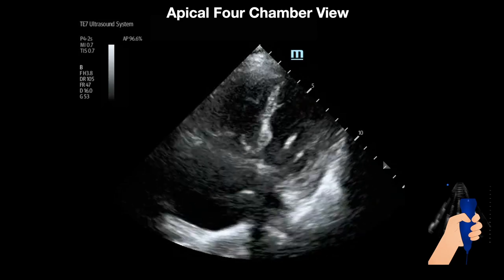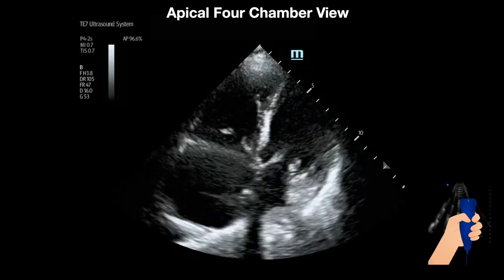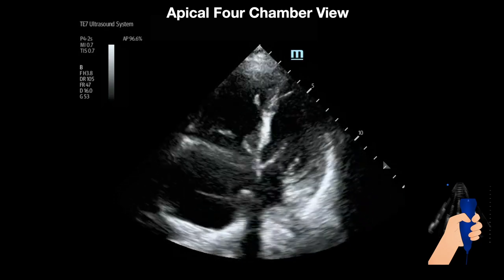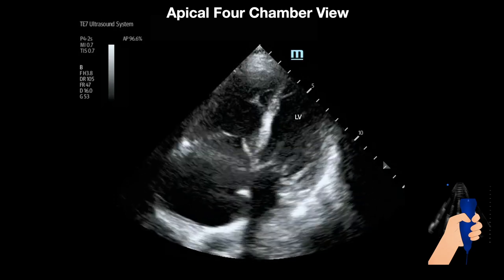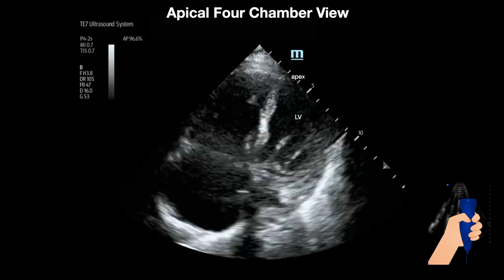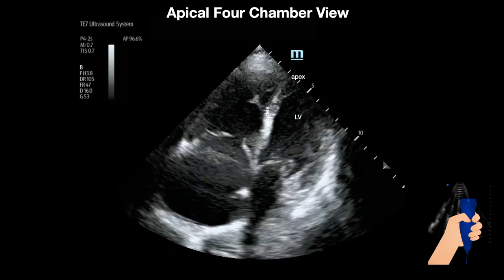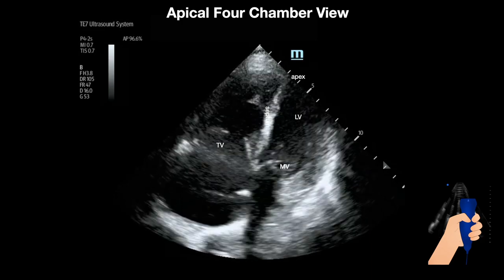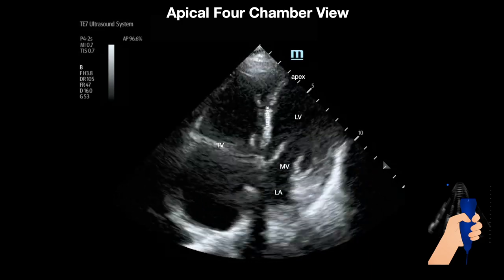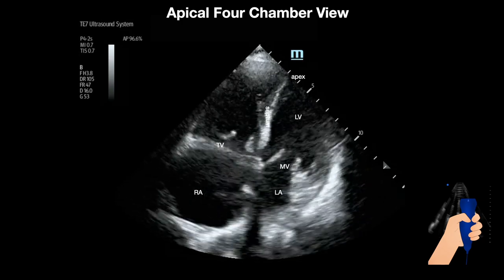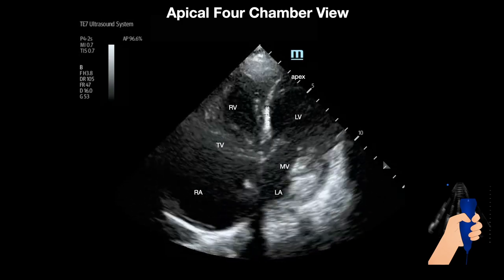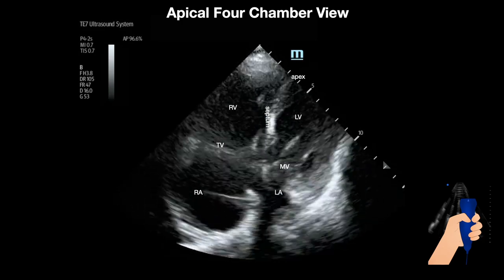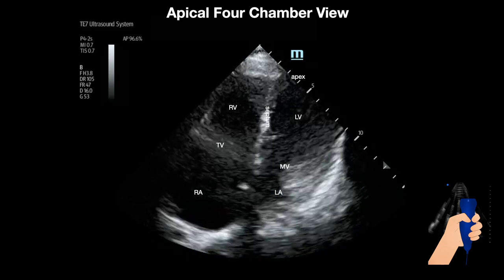Here is another patient, and this patient was also in the hospital and not able to cooperate. We can see again the left ventricle, the apex, the septum, the tricuspid valve, the mitral valve, the left atrium, the right atrium, and the right ventricle. Interestingly, this patient had atrial flutter and you can see the fluttering of the mitral valve.